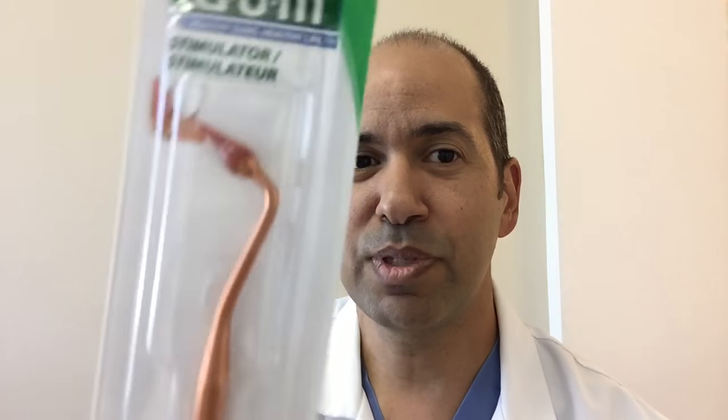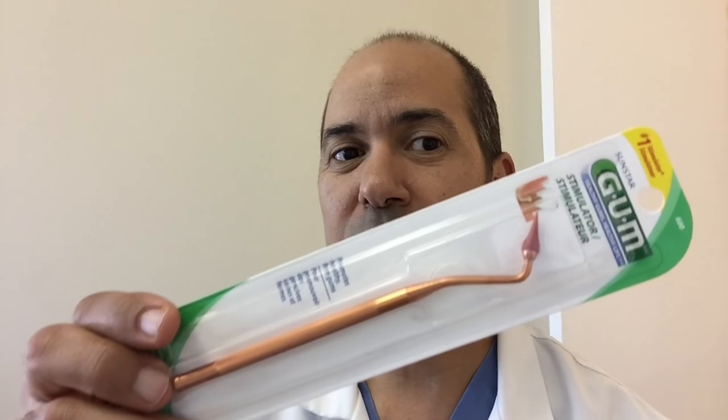For these types of All-on-4, porcelain or zirconia dental implant bridges, we also use this thing called a rubber tip. They used to put these on the back of a toothbrush. You're going to trace around your gum line with it. This goes where the toothbrush and floss do not go.